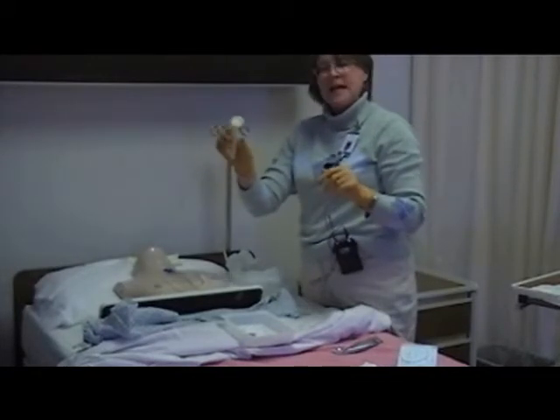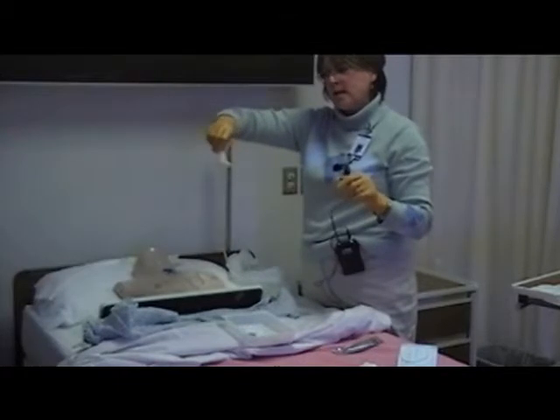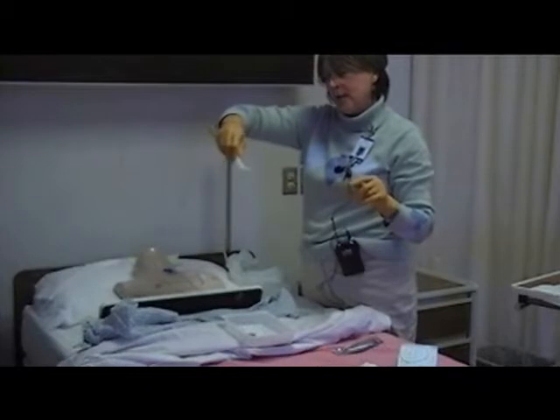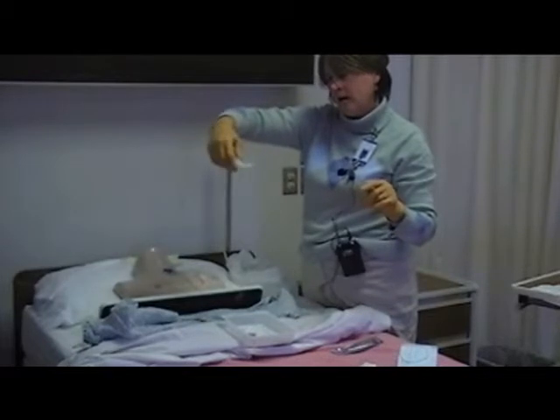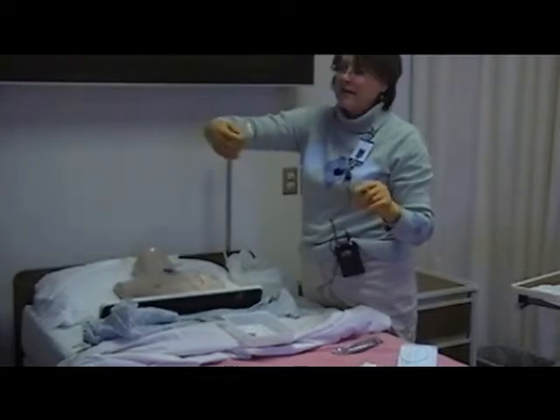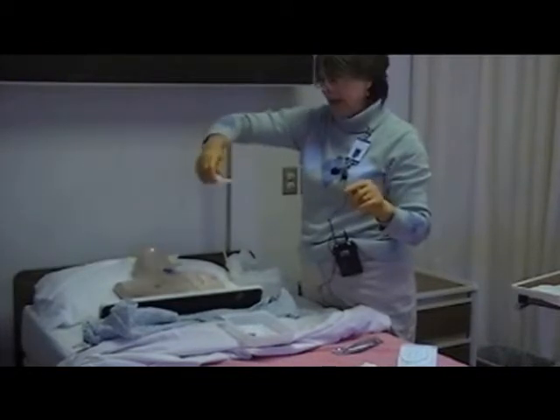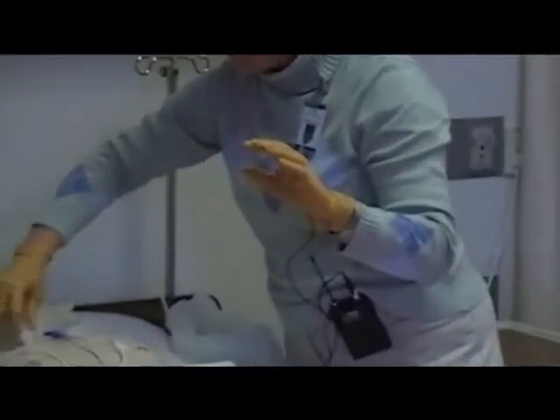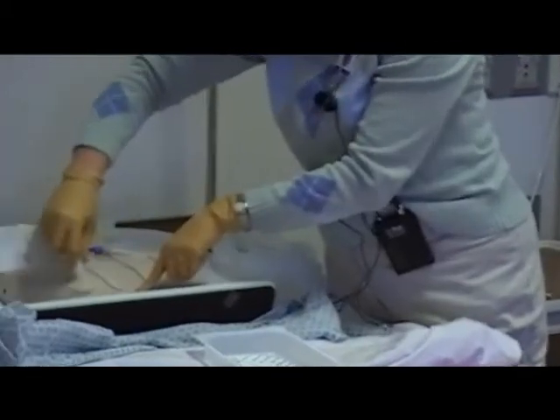The chlorhexidine has wings on the end. So you're going to hold it down, squeeze those wings, and you could maybe hear it snap a little bit. You're breaking the ampule inside that has the chlorhexidine. You're going to squeeze it several times to moisten the pad, and you can visibly see it is wet. I'm not sure if the camera's picking that up. It is moist. At this point, keeping everything sterile, briskly back and forth, and it is a 30-second scrub.